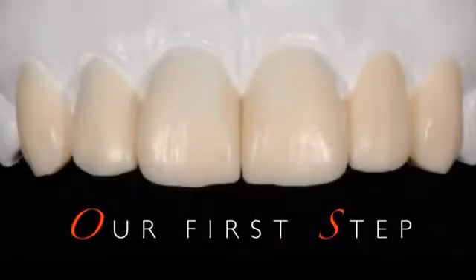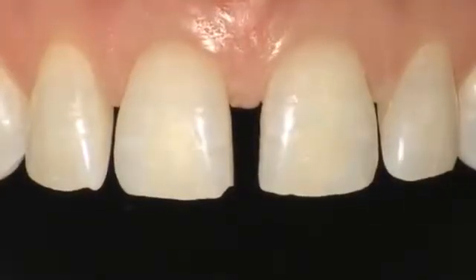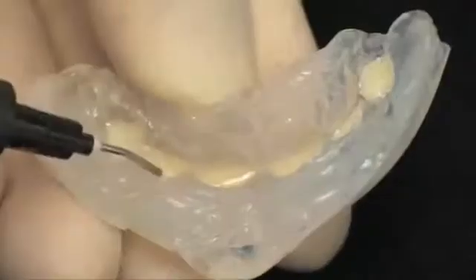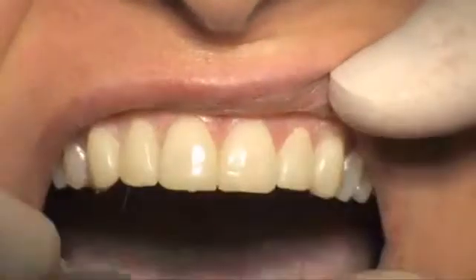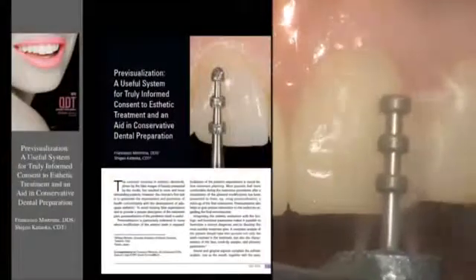Once the workup is produced, an impression is made using a transparent silicone. A flowable composite resin is then dispensed into the transparent matrix and positioned in the patient's mouth. This technique of previsualization provides a true copy of the planned shape of the teeth, allowing for an immediate evaluation of form, volume, occlusion, and relationship with the surrounding tissue.